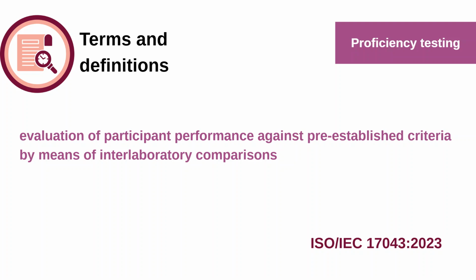That does not mean ours is not performing well. That could mean that we need some other calibration. We have to check whether the given answer is within the permissible limit. There are NABL documents which say what the limits are, and other things are available there in the document. We have to check it. Once the values are within the permissible values, then we are fine. If not, we'll have to do further calibration of the analyzers.